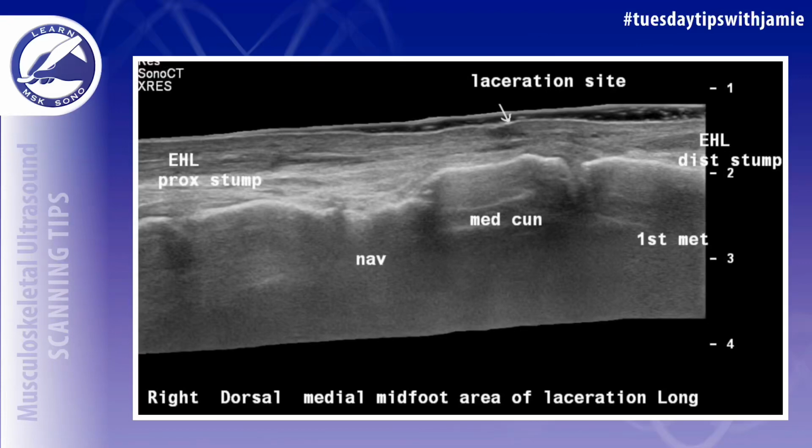Hi, what ultrasound images are necessary to prove tendon dysfunction in cases of a laceration injury?